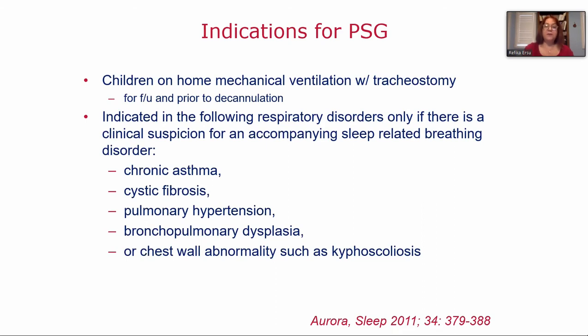So if you have a child with chronic lung disease, you only require a sleep study, a polysomnography, if there's a clinical suspicion for an accompanying sleep-related breathing disorder. So a child with cystic fibrosis or bronchopulmonary dysplasia and so forth. So in these children, if there's a suspicion of hypoxia or hypoventilation during sleep, not related to obstructive sleep apnea, you can always do gas exchange monitoring.